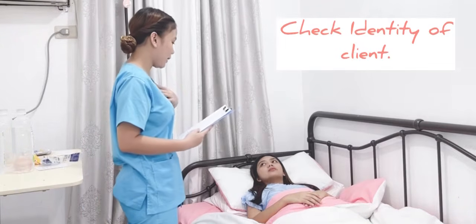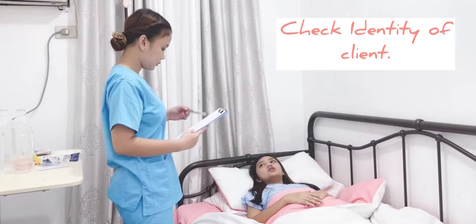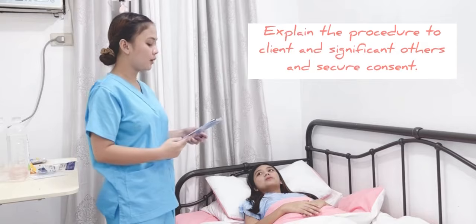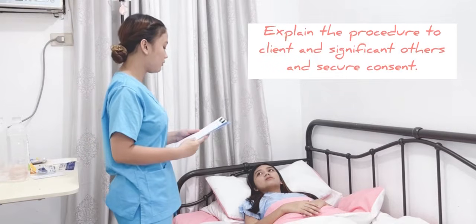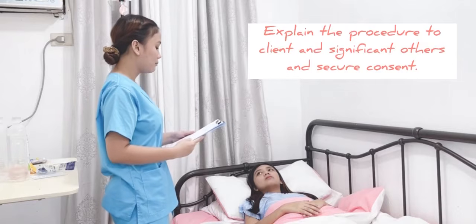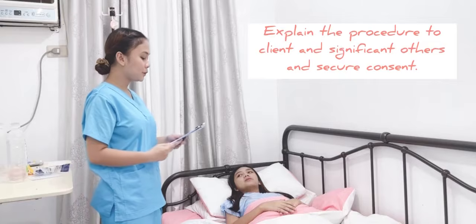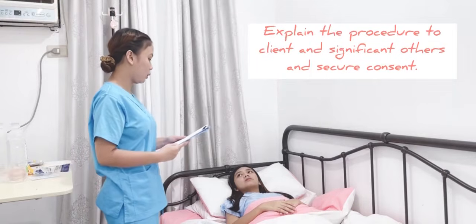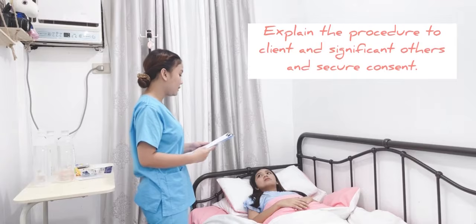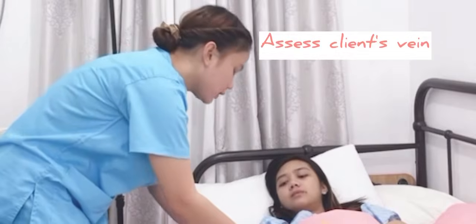I'm Nurse Yen. Pwede ko po ba malaman kung ano po yung name nyo? Kelly Junicio po. Okay po. Next is to explain the procedure to the client and significant others and secure consent. Knowledge of the procedure helps to decrease anxiety and promotes cooperation. So, ngayon po ma'am, may ibibigay po ako sa inyong gamot, yung D5LR po, 1 liter. Mamaya pong 8 a.m. Para po yun ma-maintain po yung hydration nyo. Okay lang po? Okay po.